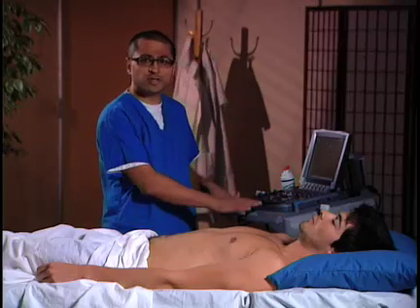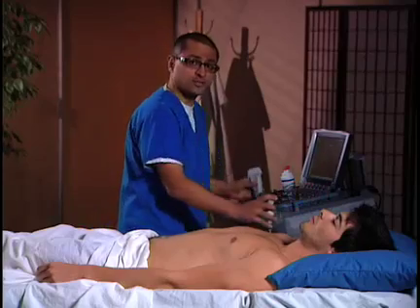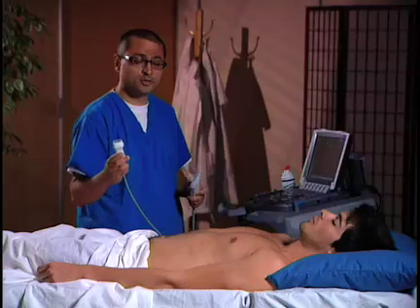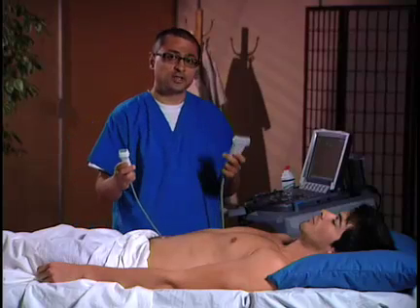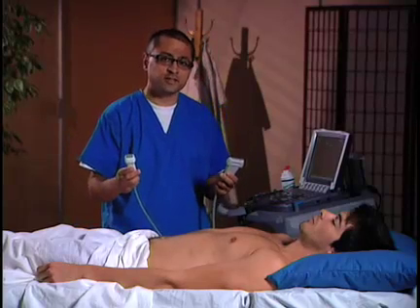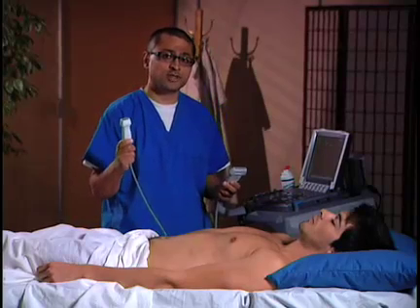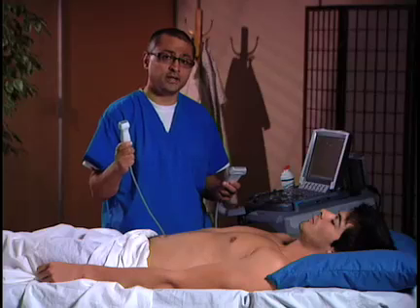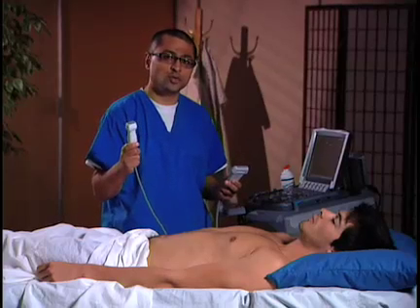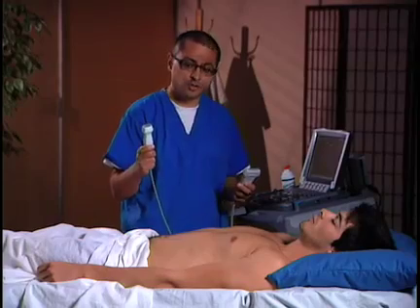We have two different choices of transducers: a phased array transducer and a linear array transducer. If you're doing this as part of the FAST exam, most likely you've already had a phased array transducer in your hand. Therefore I'm going to go ahead and show you what the images look like using a phased array transducer.